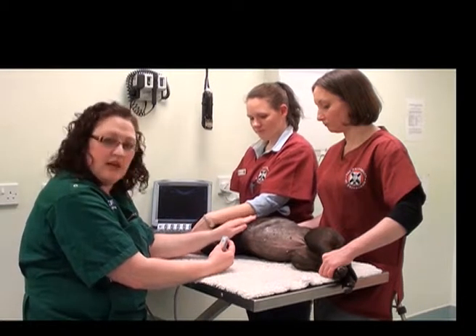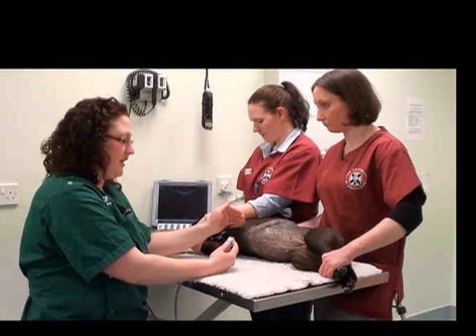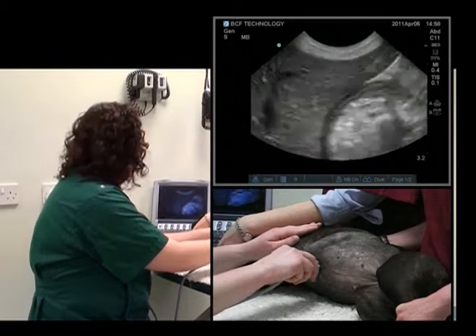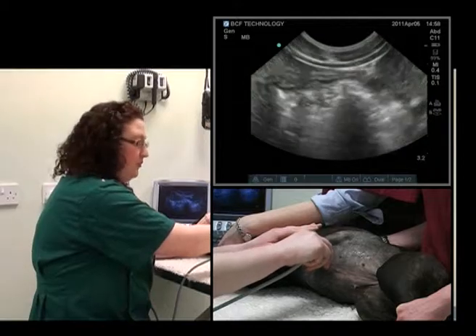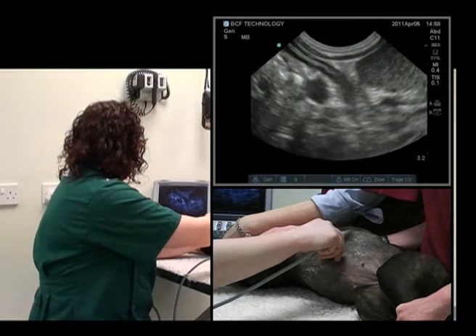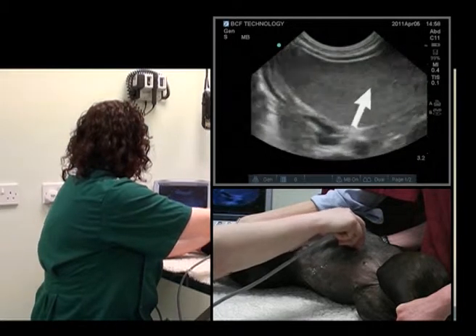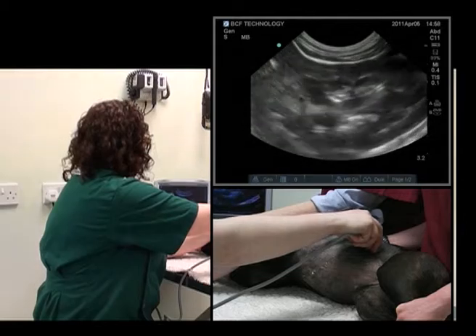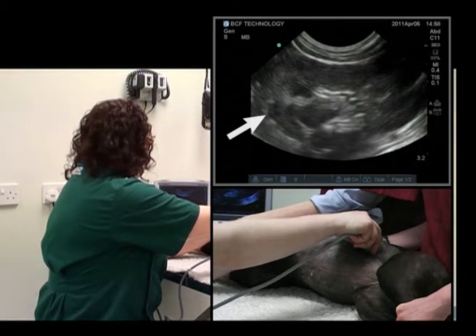What we'll do is, again, start with an organ that you know its location and are confident in finding, and that's the liver again. Again, start in a sagittal section. Follow, sliding the probe along the rib cage. The spleen will come into view. And there's the kidney. It's always a little bit higher than you think.